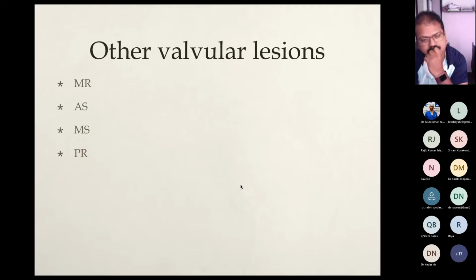Aortic stenosis, if more than mild, may cause some problem, but it's still not a major problem. But mitral stenosis, at least moderate or more, we should correct by putting in a new valve. And at least moderate to severe pulmonary regurgitation is not a problem for LVAD, but if the patient requires an RVAD, then moderate to severe PR is a problem.